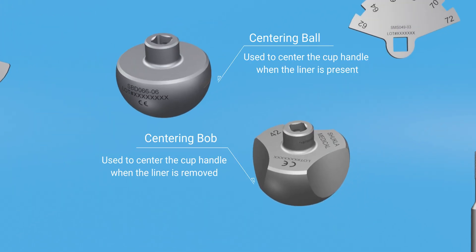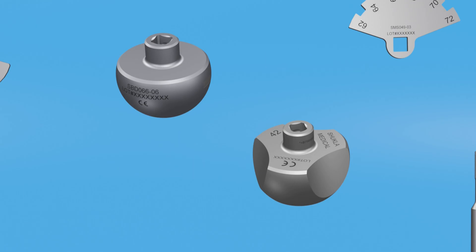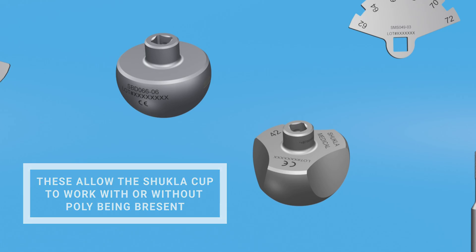Centering balls and bobs align the cup handle for proper blade placement around the acetabular cup. This allows it to be used with or without poly.